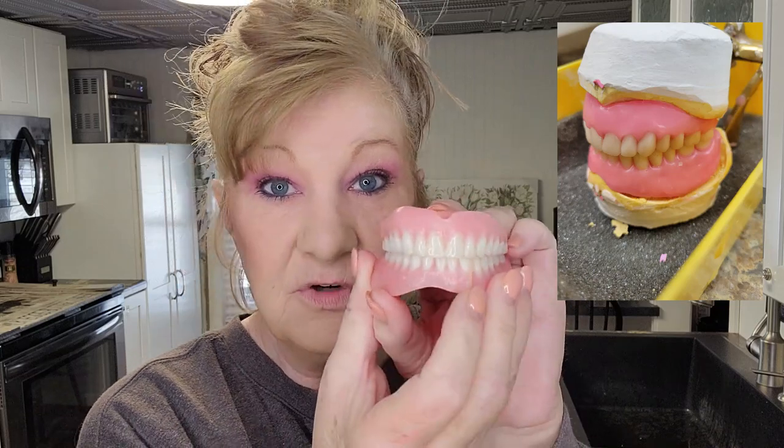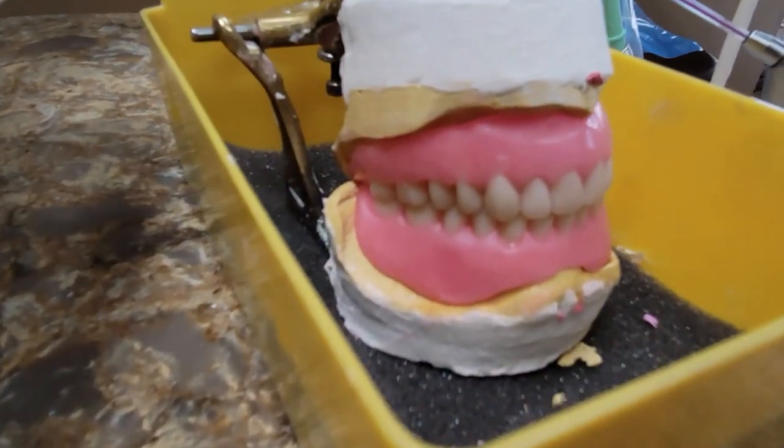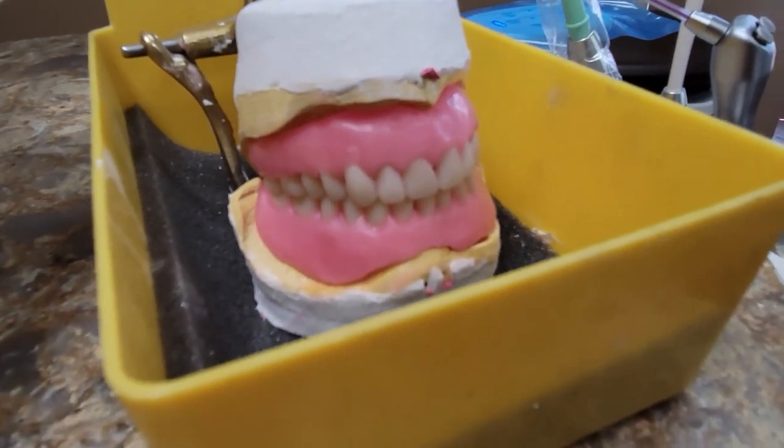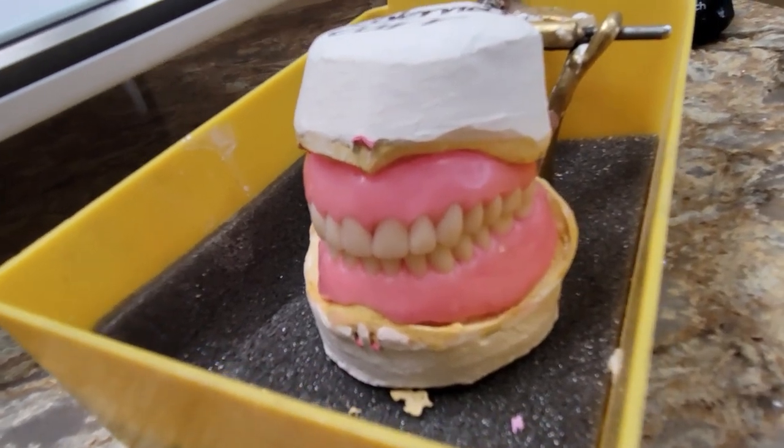This is my immediate denture. I was given a wax try-in with my immediate denture — I'm going to put some pictures in, and I have some video also. When my dentures were being made, this is my very first set of immediate dentures — call them temporary dentures, whatever you want. The dentist took impressions of my mouth and sent those impressions to the lab. The lab then knocked off all the teeth because I had my teeth still — this was before my extractions.